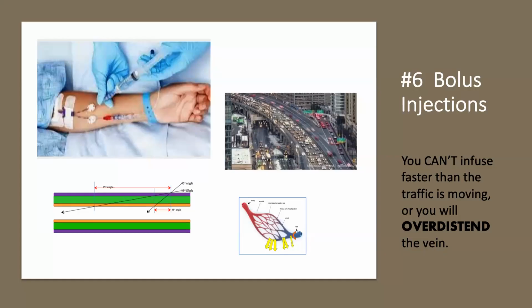Next is the bolus injections. You can't infuse anything faster than the traffic is moving, or you will over distend the vein yet again, putting more pressure on that long cut in the vein wall, causing more leakage at the venous part of the capillary bed.